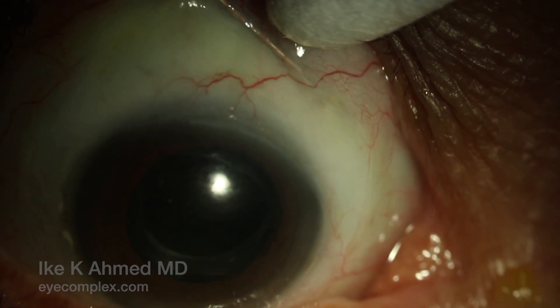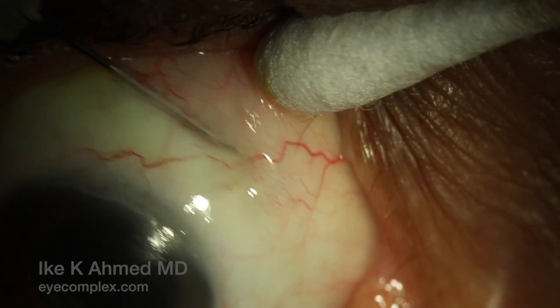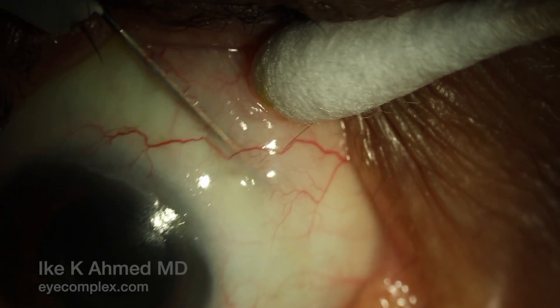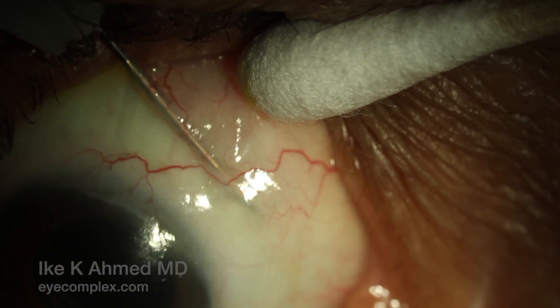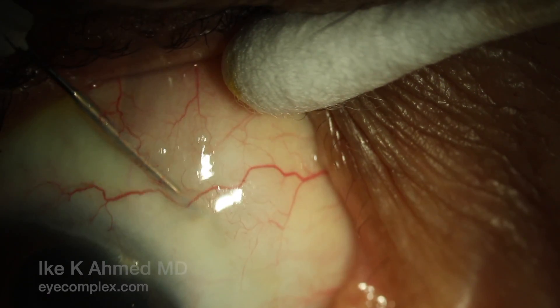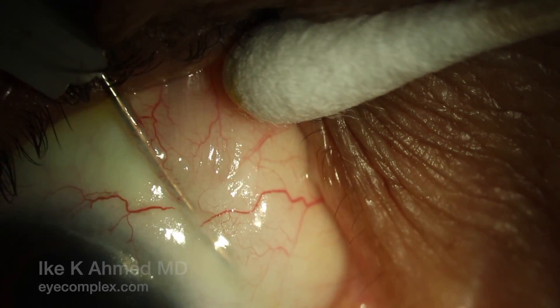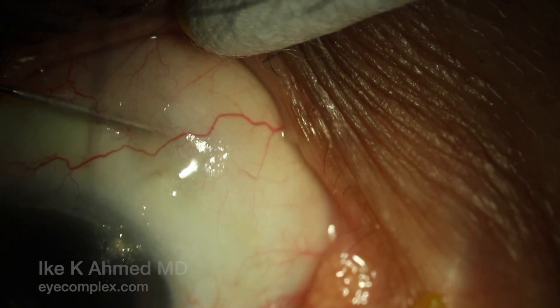The goal here is to ensure adequate flow emerging from the implant in the subconjunctival space. We already see some elevation of conjunctiva with some fluid percolation now in the subcon space, accompanied with a reduction in IOP immediately after the needling. The needle is also placed above the implant just under the conjunctiva to again release any fibrotic tissue overlying the implant as well.